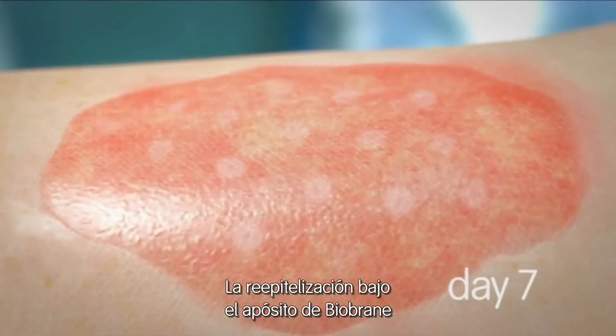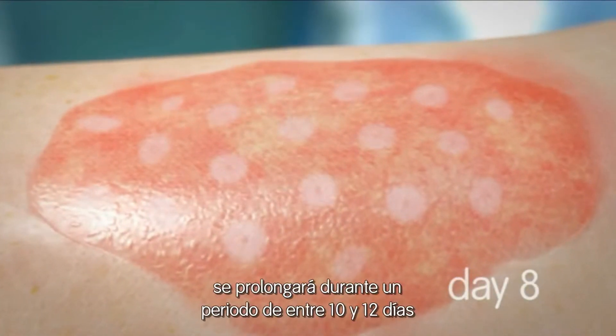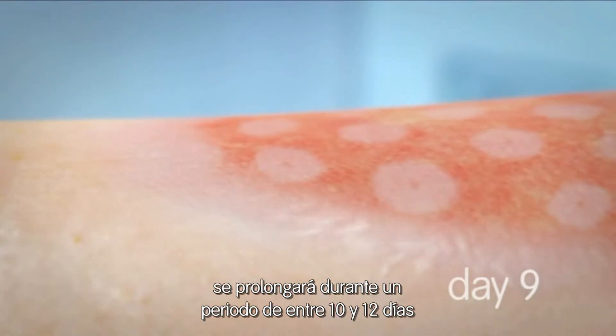Re-epithelialization beneath Biobrane will proceed over a period of between 10 and 12 days.